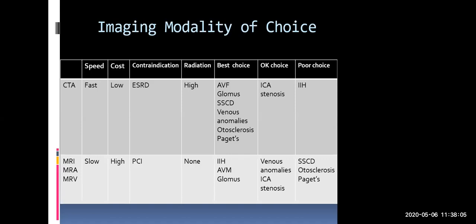Now, for intracranial hypertension, you can certainly order an MRI without contrast and an MRV to look at the venous structures, because once in a great while, you may have a patient that has a stenosis of the transverse or sigmoid sinus that creates the intracranial hypertension. So you're not dealing with pseudotumor or idiopathic, you actually have a cause. So if you have a suspicion the patient doesn't match your classic demographics of pseudotumor or intracranial hypertension, it is important to not only order the MRI of the brain and IAC with and without, but certainly get an MRV as well to look for other anomalies in there.